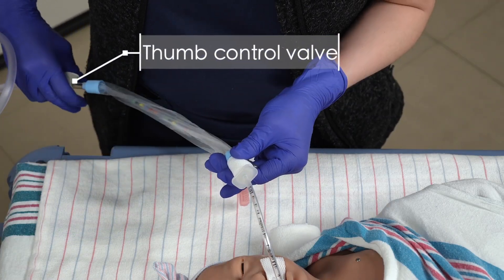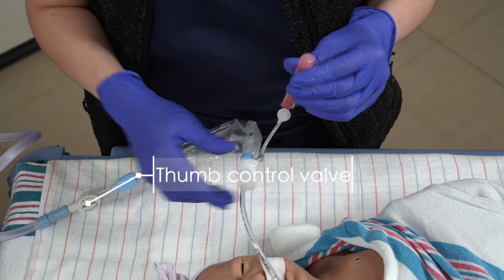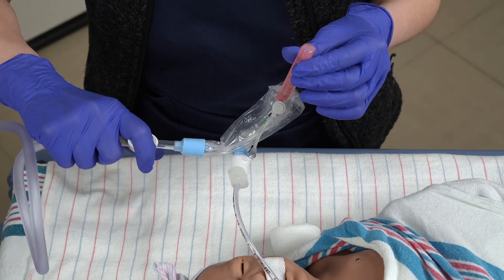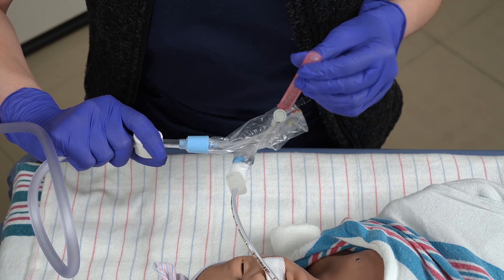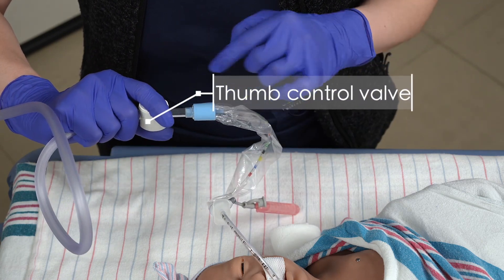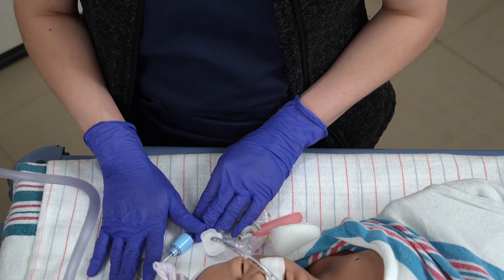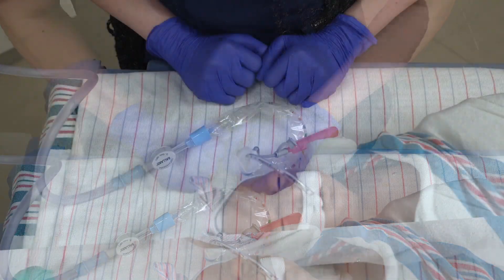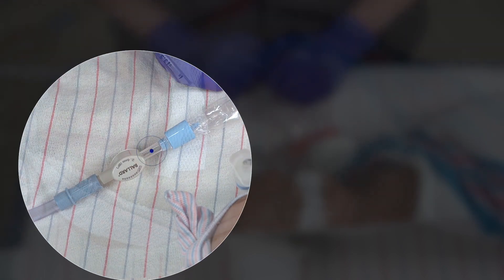Carefully withdraw the catheter while pressing down on the thumb control valve. Once the catheter is completely out, attach a normal saline bullet. Press down on the thumb control valve and squeeze the normal saline bullet to clear secretions from the catheter. Look at the window of the inline suction and assess the secretions' color and consistency.